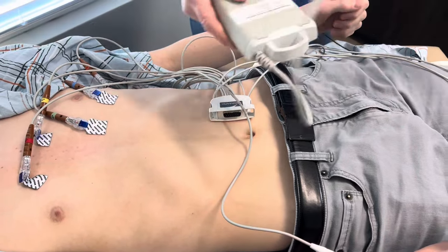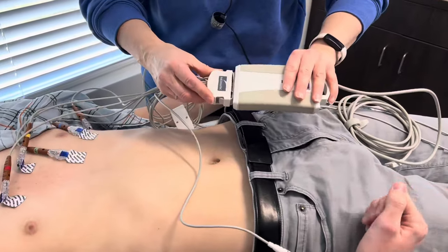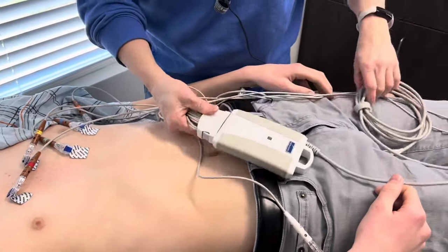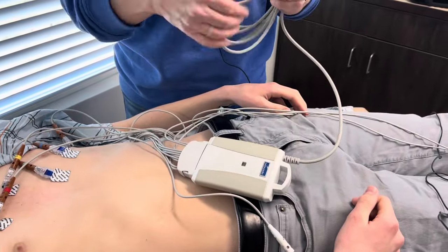How our machine works here at the clinic: it has two parts. You click this area together, and then it has a USB that connects to the computer. Now you're ready to record your EKG. You want your patient to be quiet and not talking, and remove their cell phone, as electrical current can interfere with the electricity we're picking up.